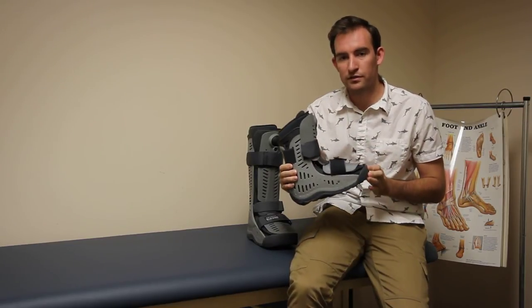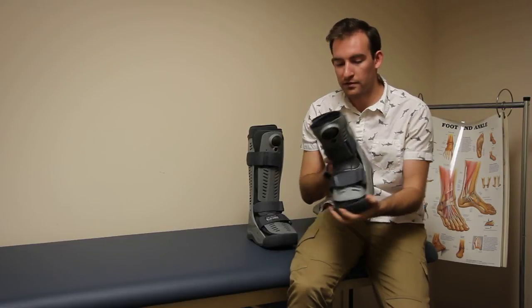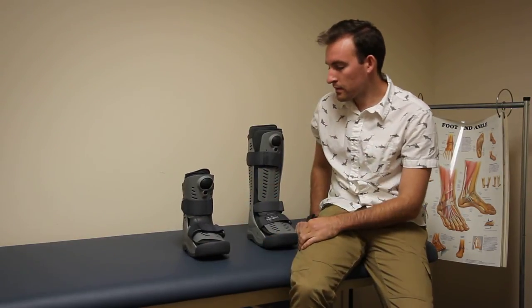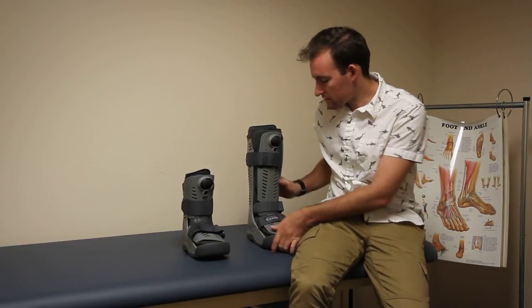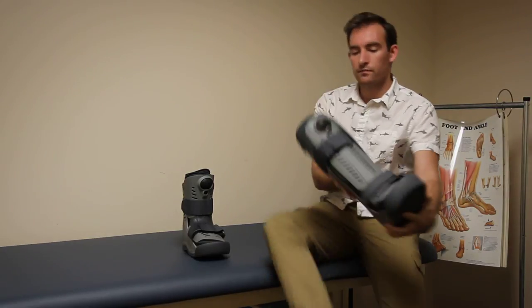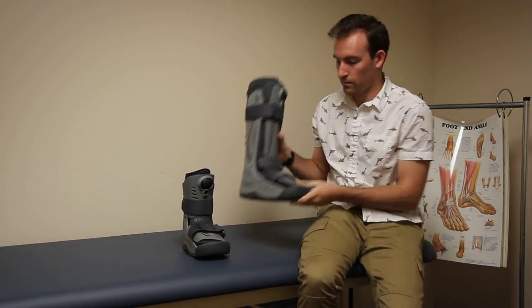This is the low-top version, available on shop-orthopedics.com, and that's the Osir Rebound Air Brace. This is the high-top version right here, for anyone that was interested — same thing, just a little bit longer, goes up the leg more. Cool, thanks guys.